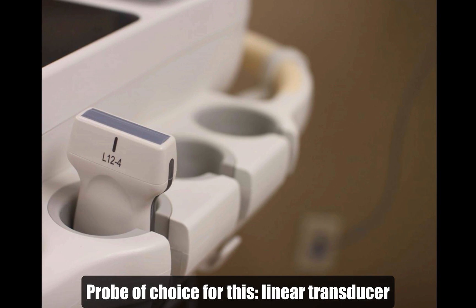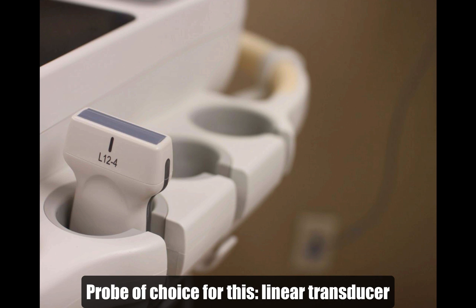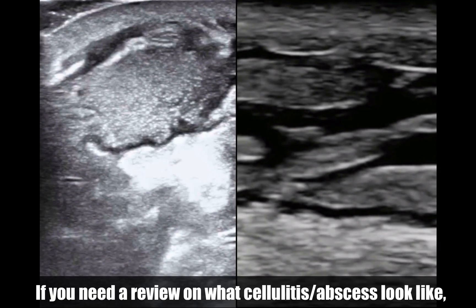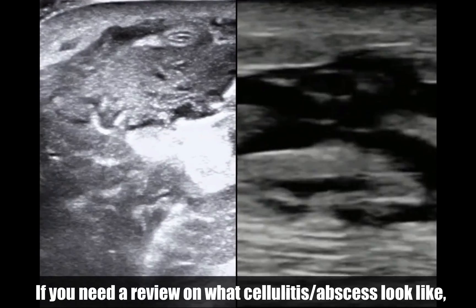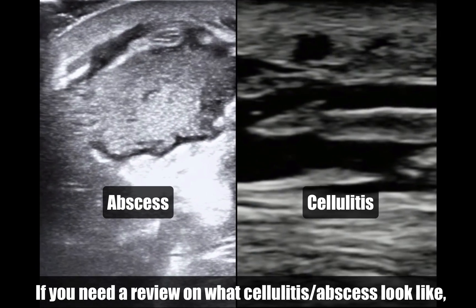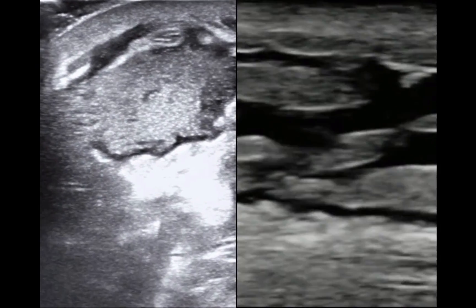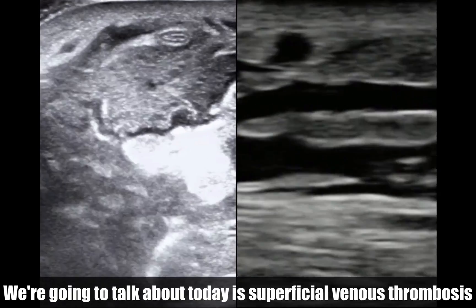Your probe of choice for this examination is going to be a linear probe — it's a superficial probe and gives the highest resolution image of the vein. If you have a patient with a red painful area on the leg, how do you differentiate between an SVT, cellulitis, or an abscess? For a review on cellulitis vs. abscess, go back and watch the 5-Minute Sono soft tissue video. Here we'll focus on what a superficial venous thrombosis looks like.